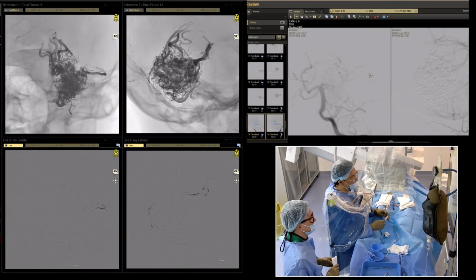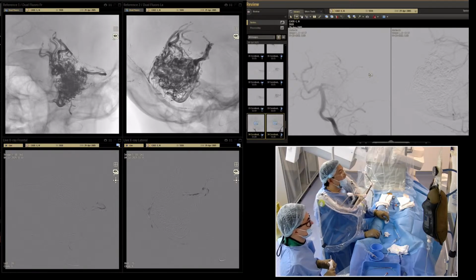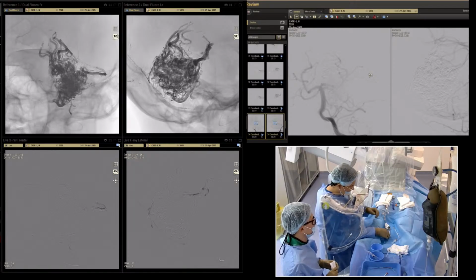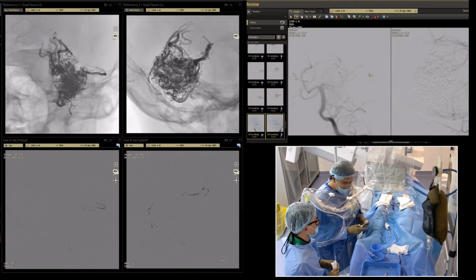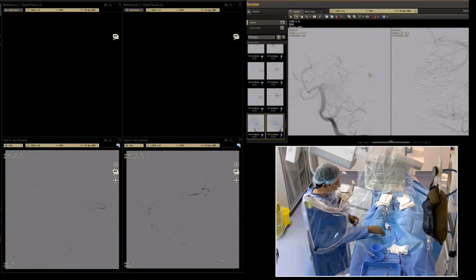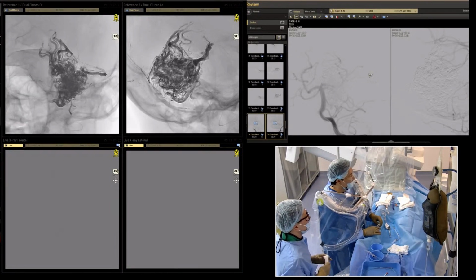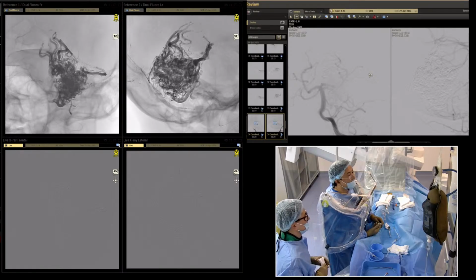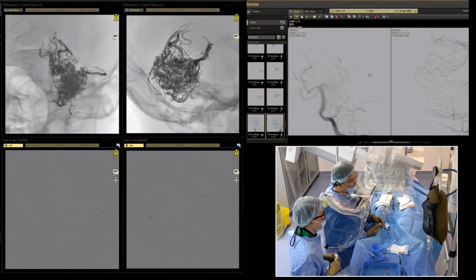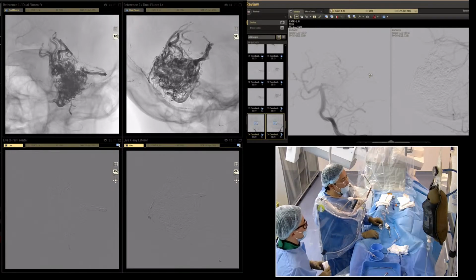We are at marker number 3. It's maximum reflux. Let's wait a little bit and then we can inject from the dural and we can take out the dural microcatheter. It's a continuous injection. And there is a reflux. Okay.